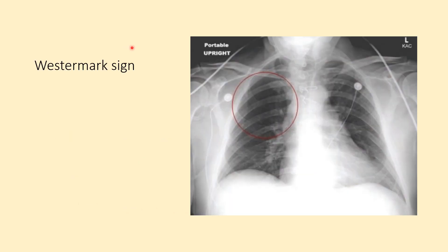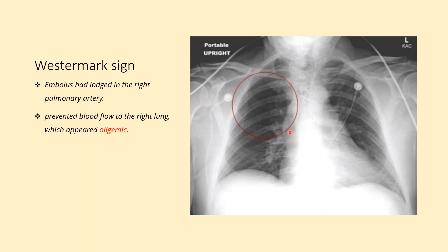One of the signs to be discussed is the Westermark sign. This is an X-ray of a patient suspected of pulmonary embolism. An embolism was lodged in the right main pulmonary artery — you can see it enlarged. As a result, there was decreased blood flow in the right upper zone, and so a lucency was seen with features of oligemia. This sign is known as the Westermark sign, or decreased vascularity.